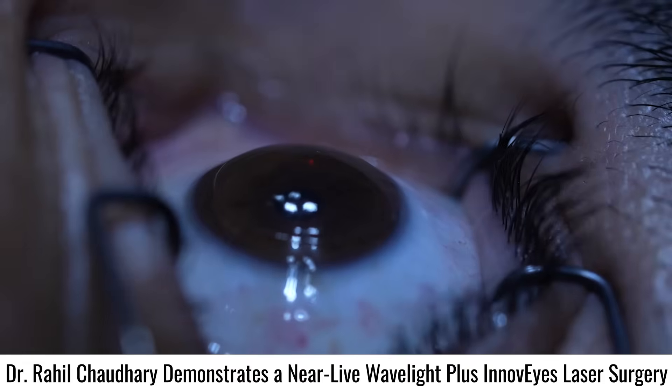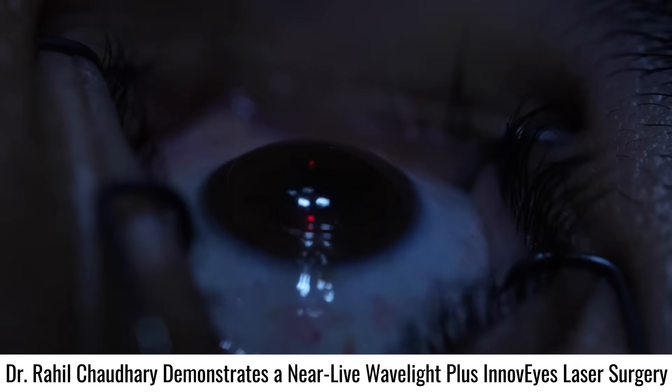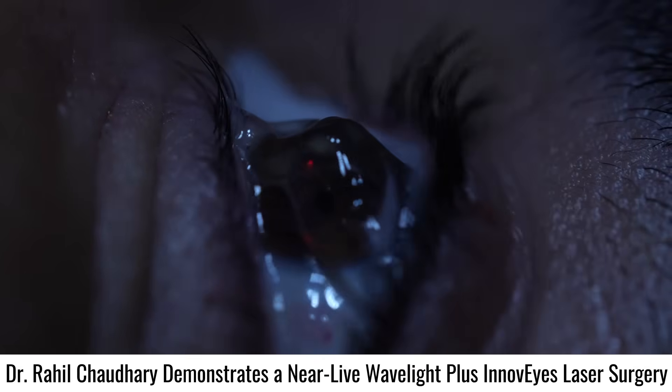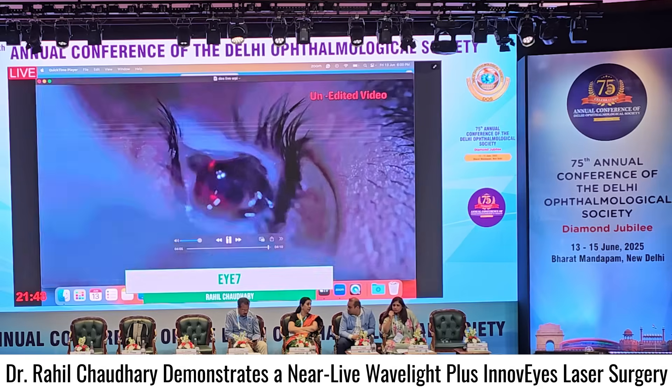Just waiting for two minutes, and then a drop of antibiotic steroid, lubricating gel, and the surgery is complete. Thank you.